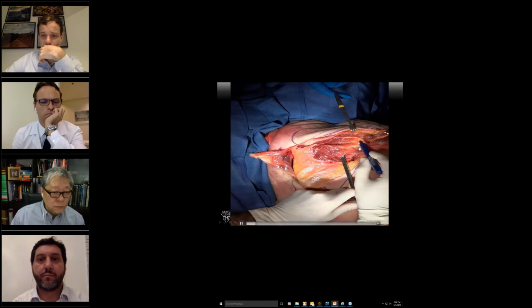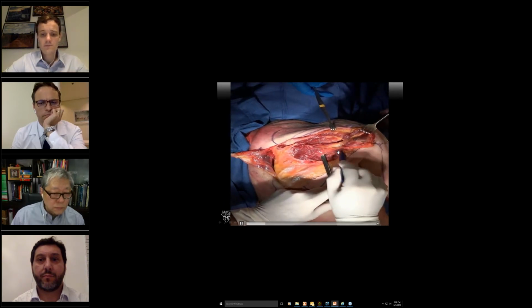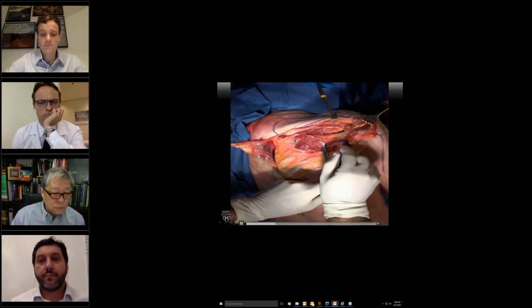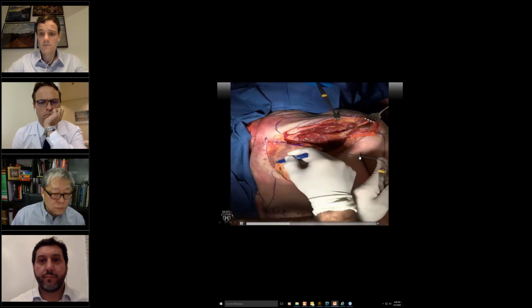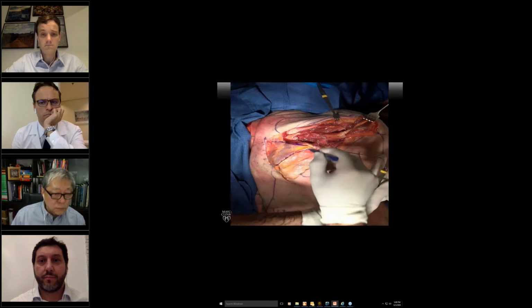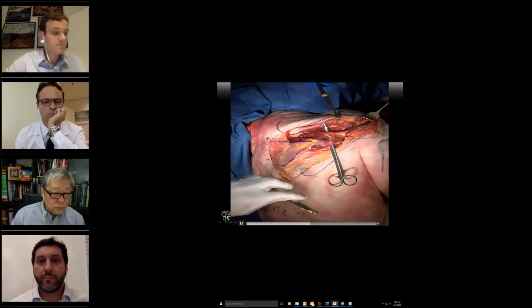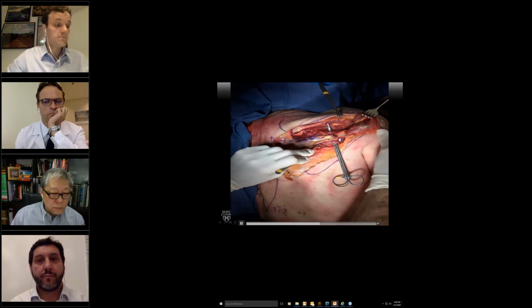Again, this is the infraspinatus, peeling the tendon, just reflecting the deltoid a little bit, just to show the line of pull of the infraspinatus. Look at this very nice tendon. Latissimus is good. It may depress the head, but the line is more vertical. So even though they're coming from the same side, it is good. Now we're going to start to focus more on the line of pull. And you can see now the line of pull. You can do a direct transfer of the lower trapezius to the infraspinatus.